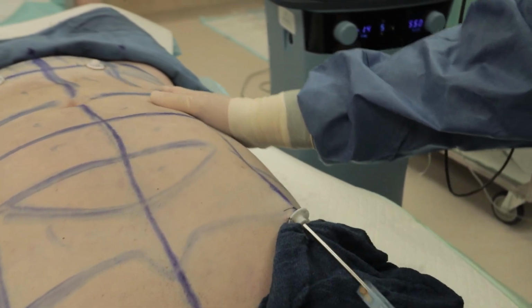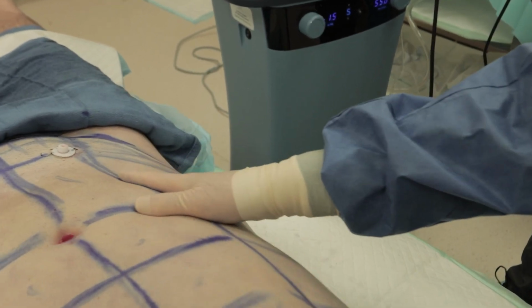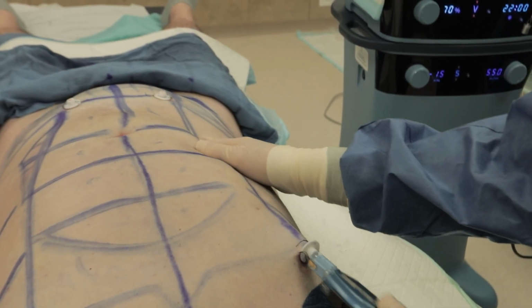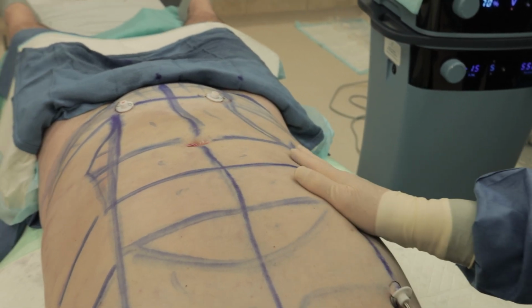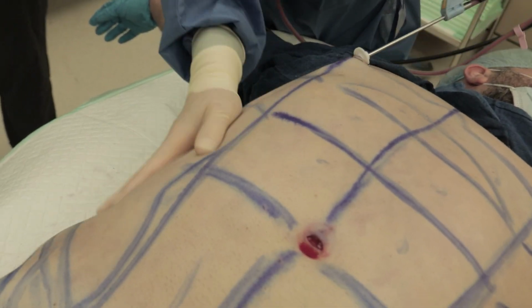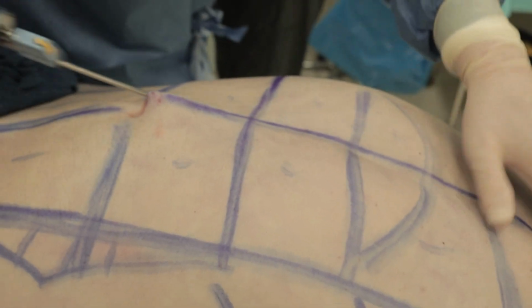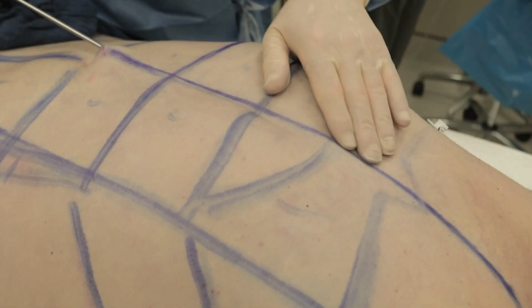It's curved. I can curve it up, get superficial, 20 degrees, and look where I am. And from neck to nuts with the one cannula. And I could carve it down to get this beautiful semilunaris, I call it. And into the flanks. All the way back here now. And again, we're going to get him on the side. I want to etch between the pec muscle. Give him some nice, beautiful definition there.